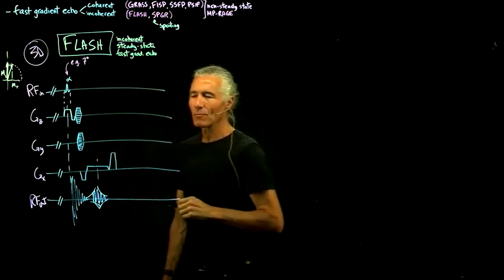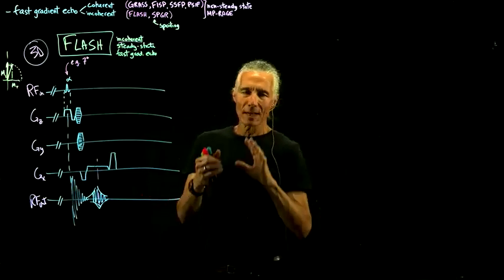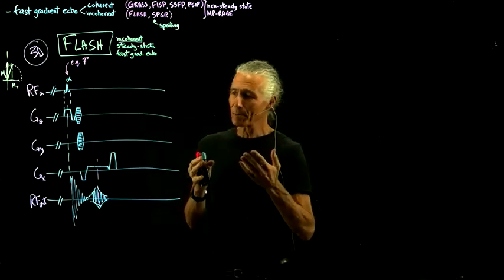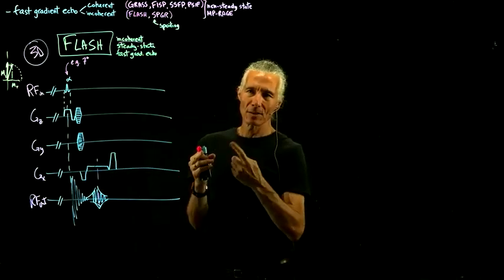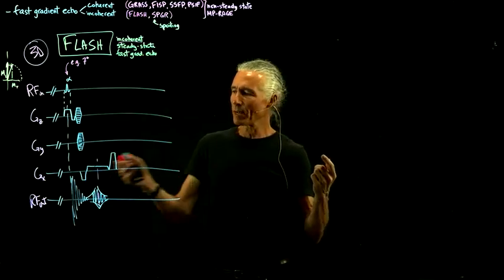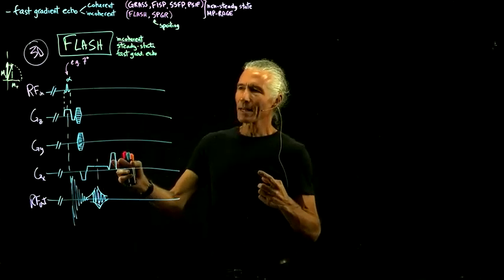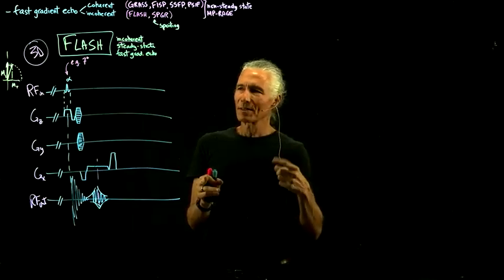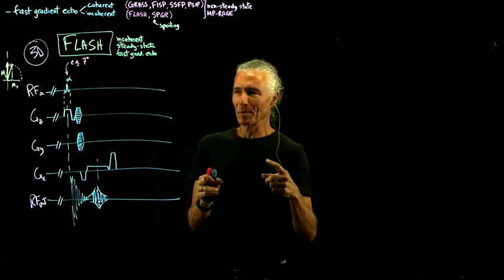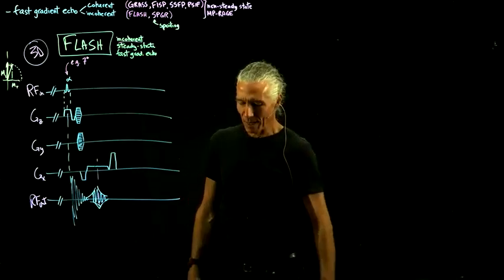We could put a really big gradient on, and what does that do? Well, you've got some magnetization stripes. You're at the right side of k-space, so maybe there's 128 stripes in spin phase going across in the x direction. What if you turn on a big gradient like this? It will wrap it up to 768 stripes or something, a really high number of stripes.